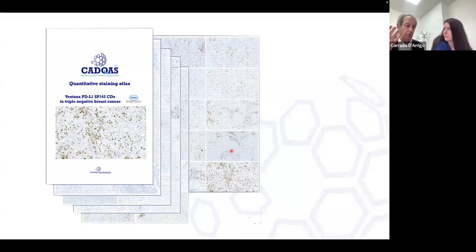Because I think ultimately, none of us will have the endurance of Emilia in cutting out each little one. They've done this with us. They've done it out of love. But this work means that I can now understand that that type of pattern means 1%, that type of pattern means 5%, and then I can do the averages. Cool. This is available online, I think.